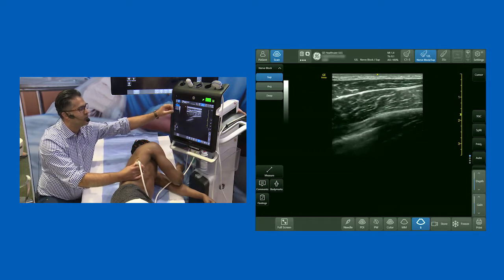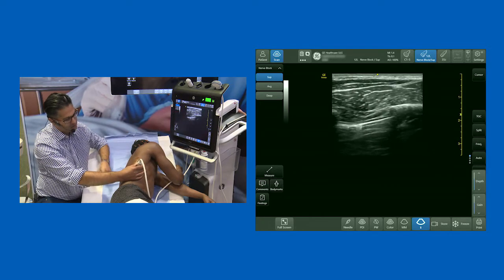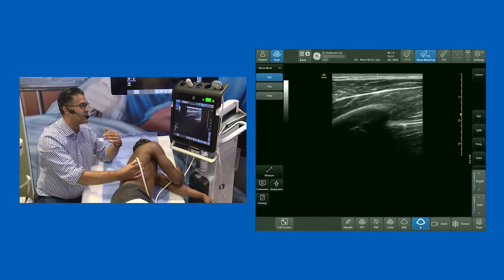We've got a very small level of adipose, LD on top, serratus below that, and with the probe in a transverse orientation, right below that you've got ribs, and then deep to the ribs you've got the pleura. This is kind of the setup I like to have.